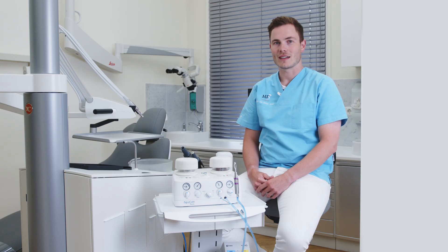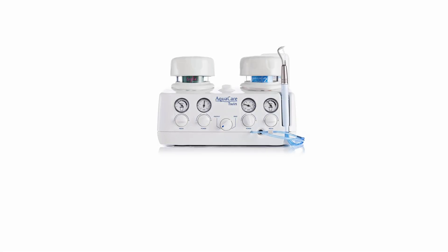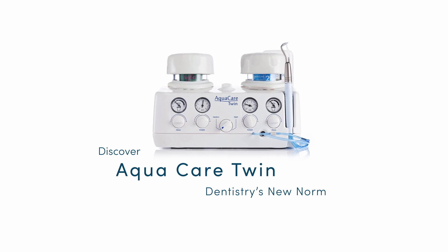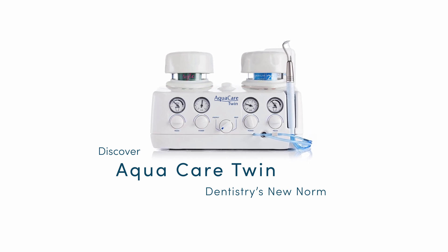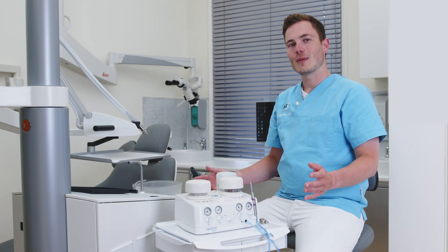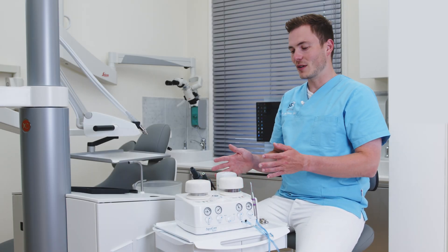We from Karma Dentistry are going to show you why we use the AquaCare every day in daily practice. I would like to talk to you about the AquaCare abrasive unit.